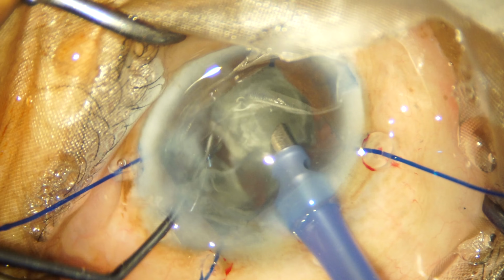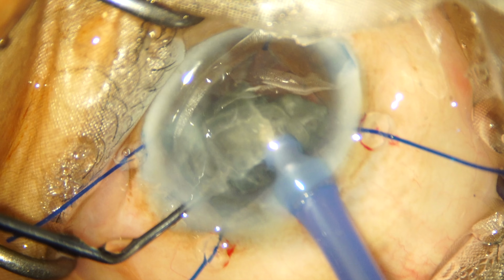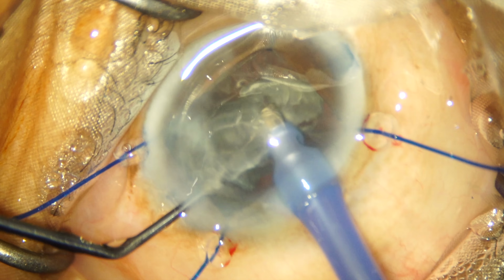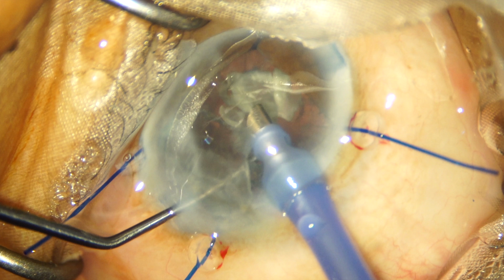You could very well say that I could have used a pupil expansion device such as the B-Hex ring that was devised by Dr. Soosan Jacob, or the Malyugin ring. However, I don't have any experience with those devices, and my training initially had been only with the iris hooks, and I'd like to very soon begin using those devices.